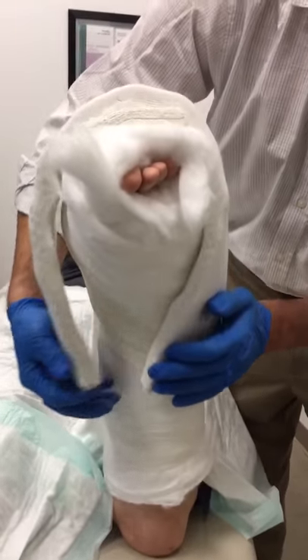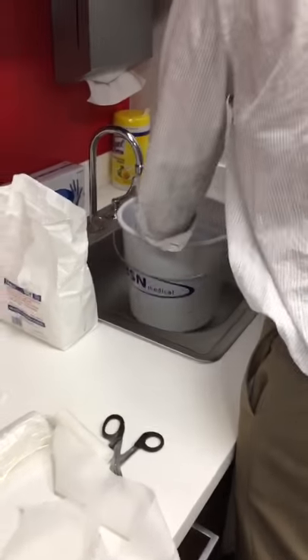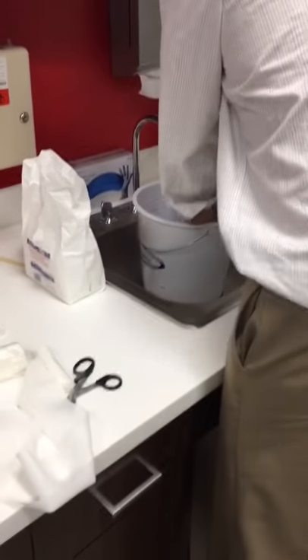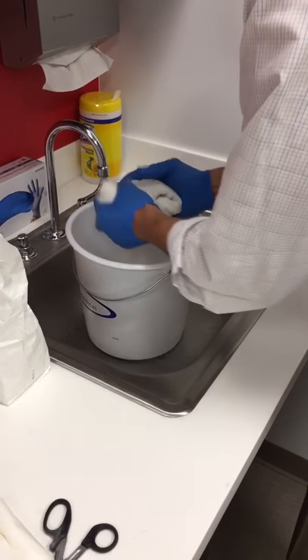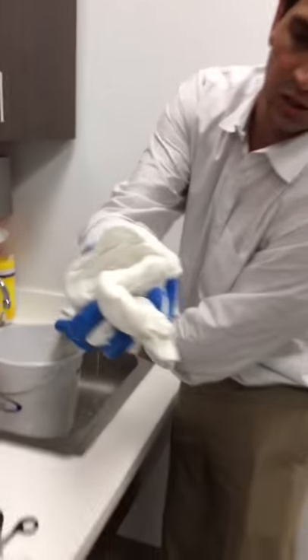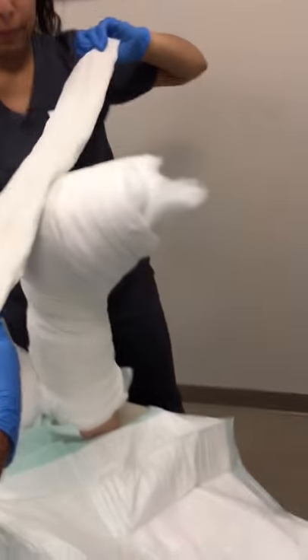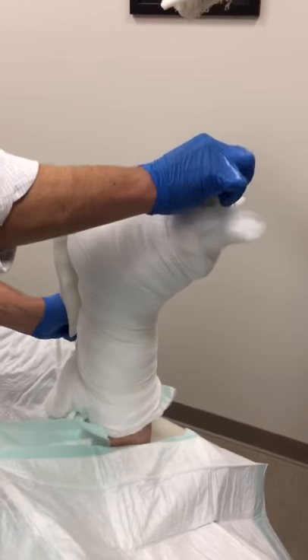Now we're ready for getting these wet and applying them. We use warm rather than hot water in case it ends up touching the skin — it won't burn their skin. Especially in the operative setting, if they've had a block, they may not feel it, so you want to make sure that the temperature of the water wouldn't burn their skin in case it came in contact with it. Posterior mold first, followed by the U.